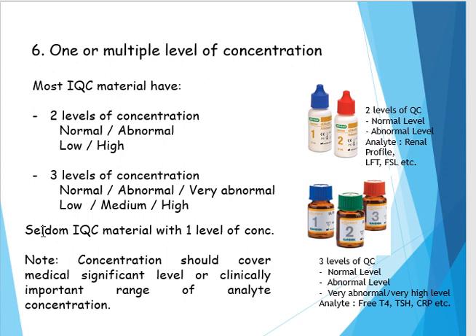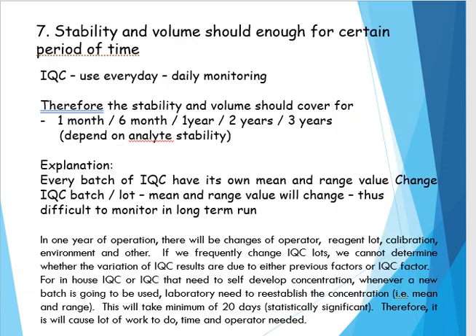Previously there was, but nowadays it is very difficult to find QC with only one level of concentration. And the concentration should cover the medical significant level or clinically important range of analyte concentration. Medical significant level, in easy meaning, is the concentration at which the doctor will decide whether the patient is normal or abnormal, or the patient needs treatment or doesn't need treatment. So QC concentration should cover that medical significant level.